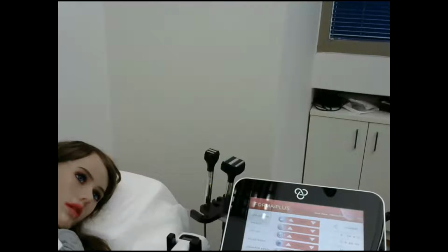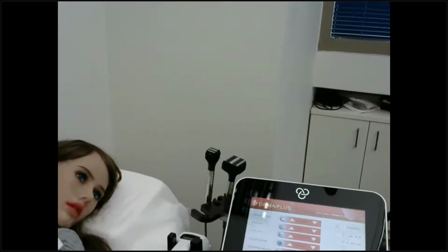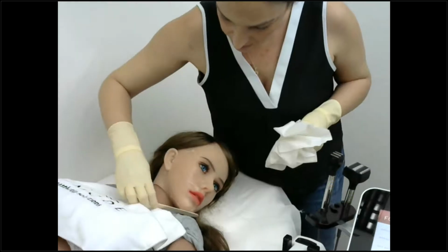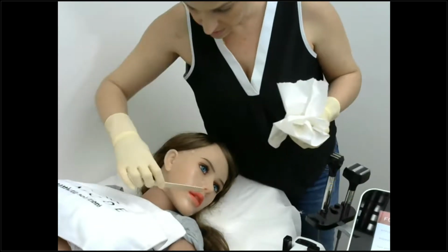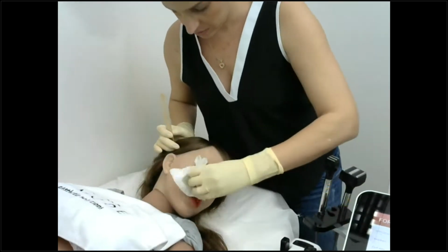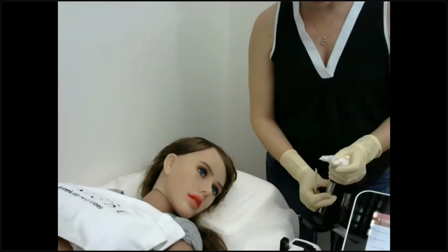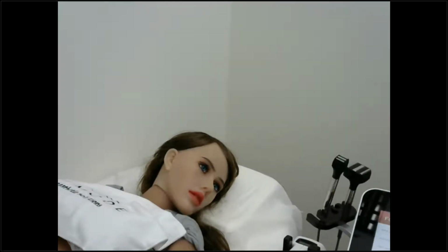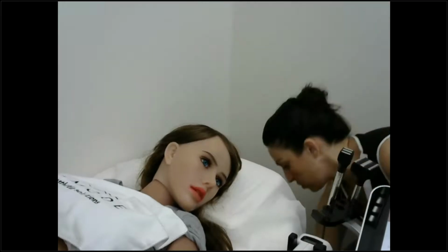Okay. So I will now clean up my patient and my applicator and move on to the Plus. I will finish it up later with your permission. What I do want to make sure is that I clean up my applicator. This is something I always like to demonstrate, because it is very important that I keep it clean. I want to make sure I remove all gel leftovers. I don't want them to dry up on my applicator.